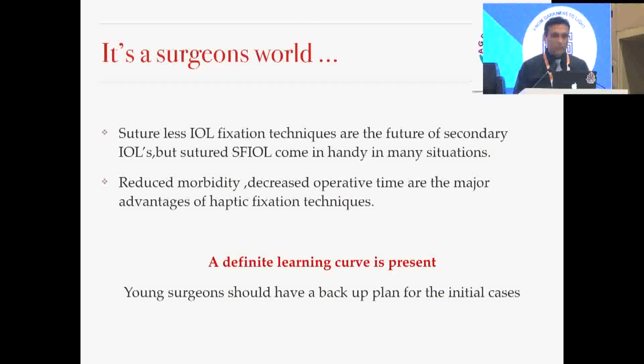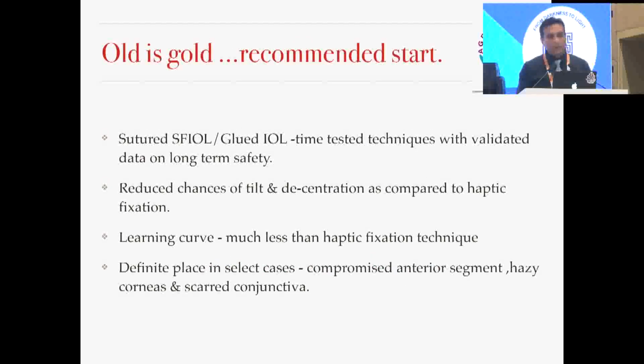So just to conclude, sutureless IOL fixation techniques are the future of secondary IOLs, but still sutured SFIOL comes in handy in many situations. Of course, the advantages of sutureless IOL fixation techniques are reduced morbidity and decreased operative time. But a definite learning curve is present, and younger surgeons should have a backup plan for the initial cases. Sutured SFIOL are time-tested techniques with validated data on long-term safety and have a reduced chance of tilt and decentration. I think the learning curve is much less than the haptic fixation techniques, and they have a definite place in select cases like a compromised anterior segment and a poor iris support.